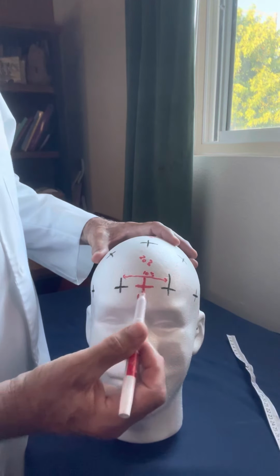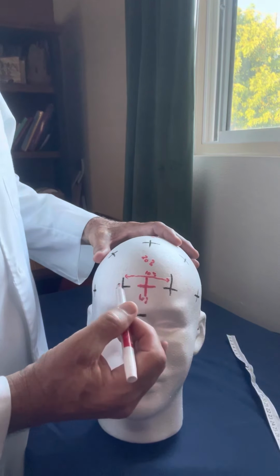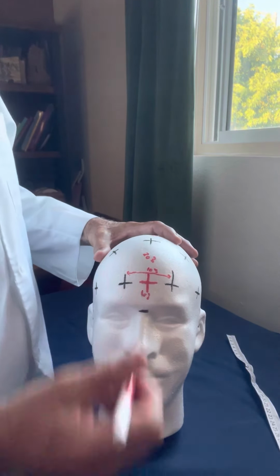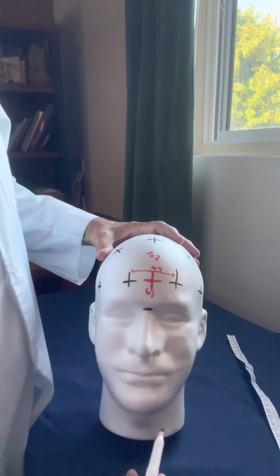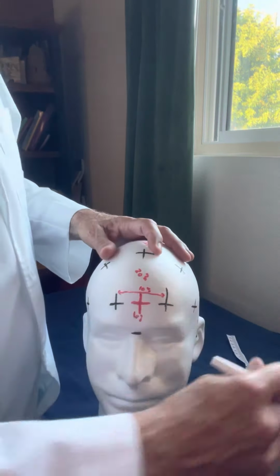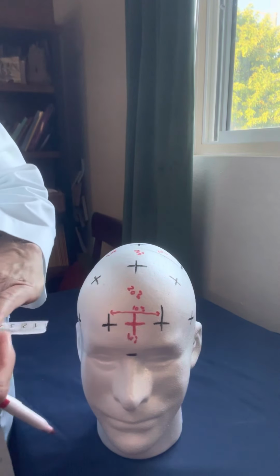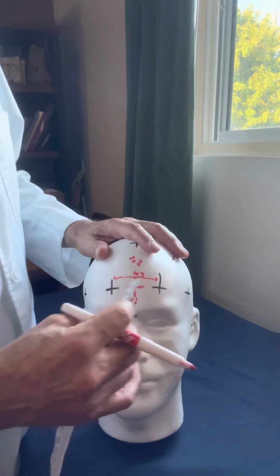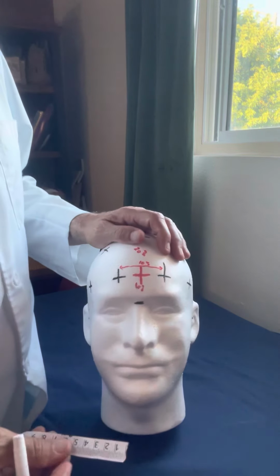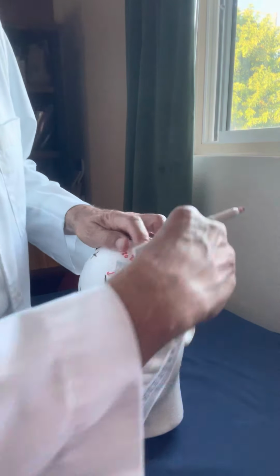On each side, 10% of half the distance and 10% of half the distance here is actually 10% of the whole distance. Since the circumference of the head was 55 centimeters, the distance between FP1 and FP2 should be about 5.5 centimeters, which is 10% of 55. So let's go ahead and measure that.